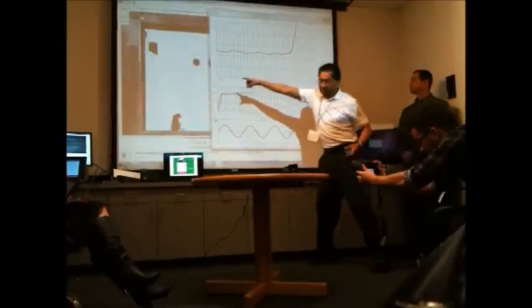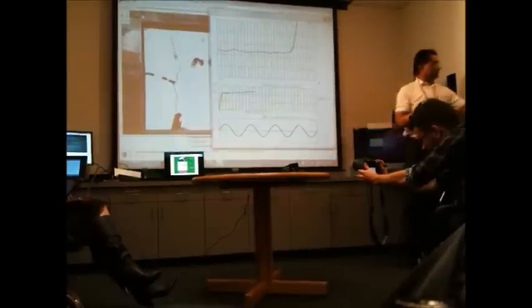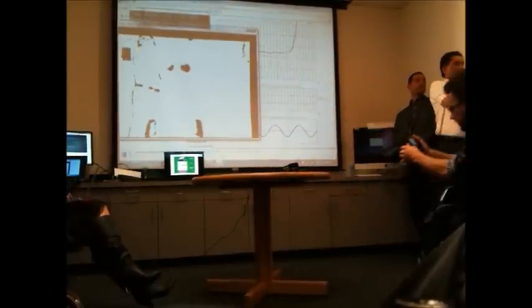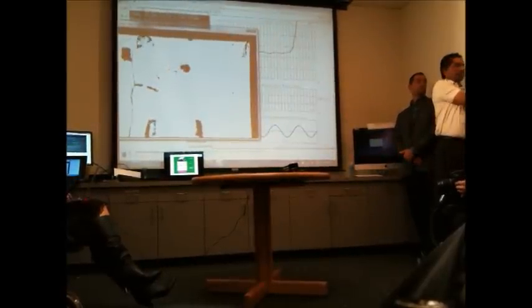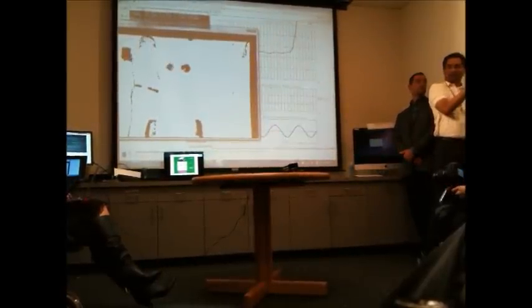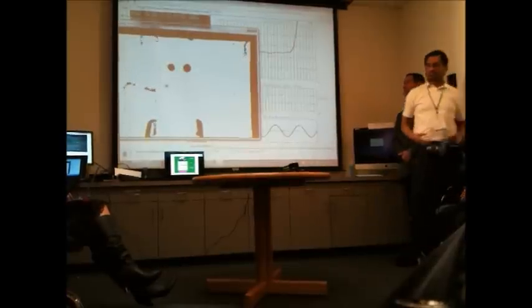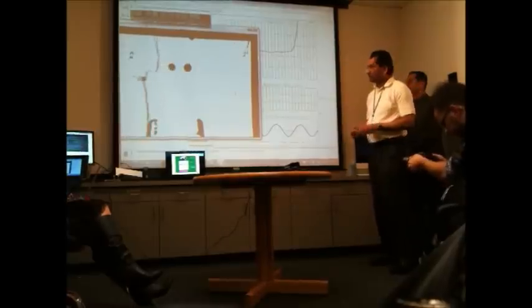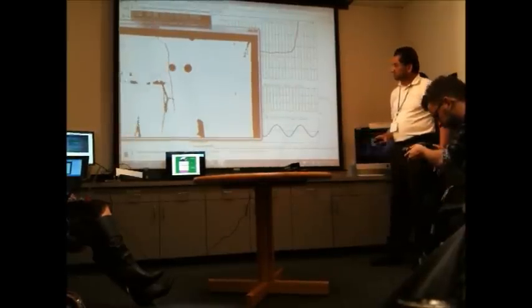What we're using is a depth map — we calculate how much change there is from one surface to the captured reference surface. We're using the whiteboard as the reference for these calculations.